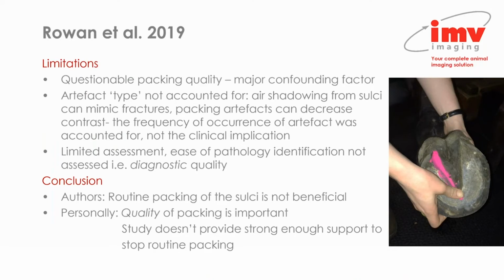So the limitations of this study, I really question the quality of packing, and I think this is a major potential confounding factor in this study. The type of artifact was not accounted for. They said that there were artifacts present, more so in the packed than the unpacked images.